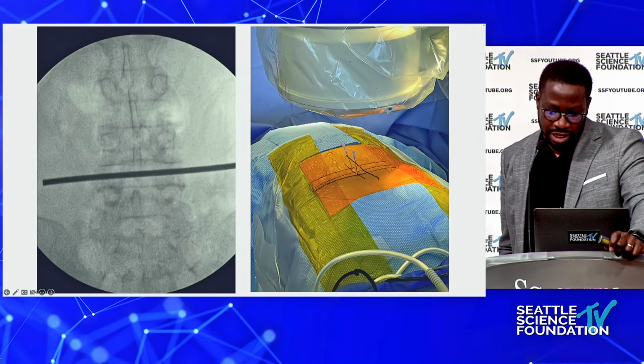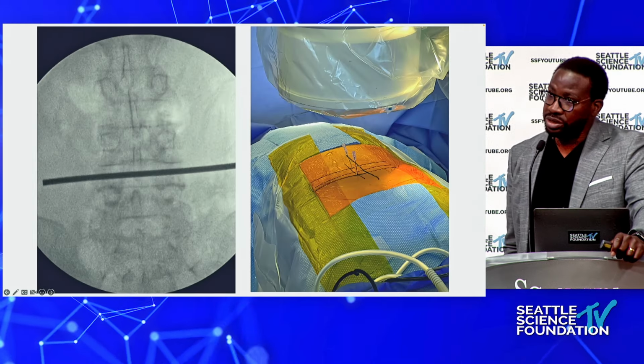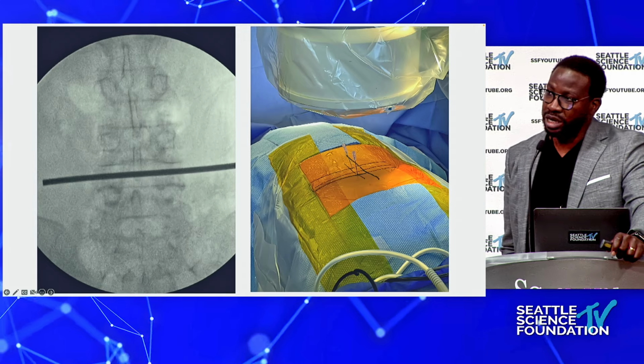So with that, we'll let Jon take it away and show us the targeting for biportal endoscopic surgery.